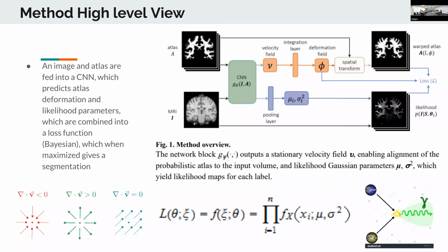I think that you still get a lot of value out of this though, because the probabilities in these atlases are probably pretty fixed, but what this would allow you to do is, when you move to a new MRI machine or there is covariate shift in your MRIs, you would not need any labels on that to fine tune on a new data set.